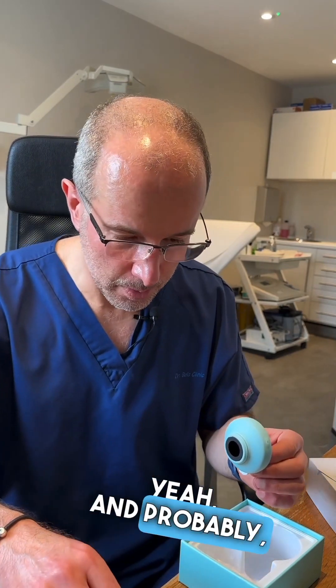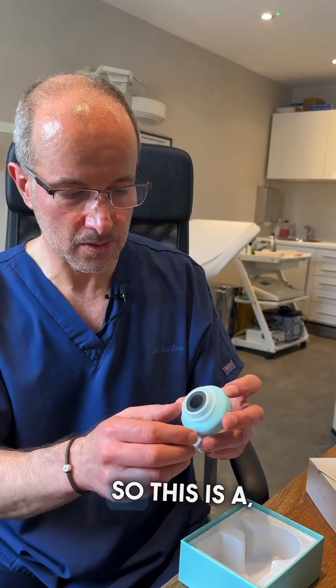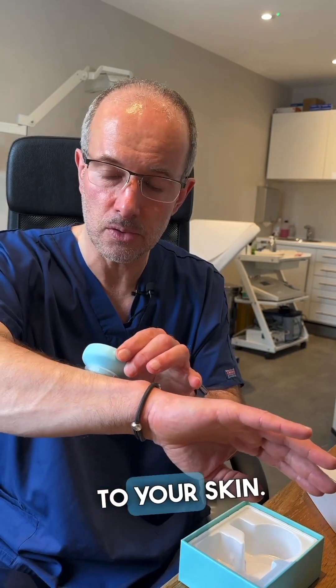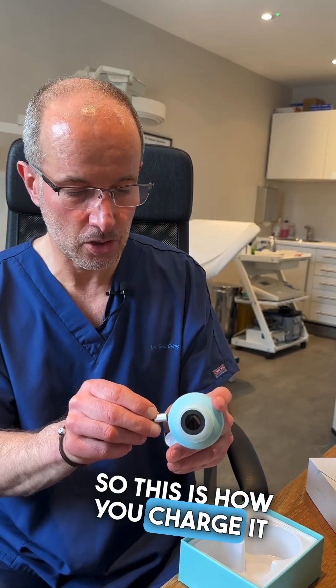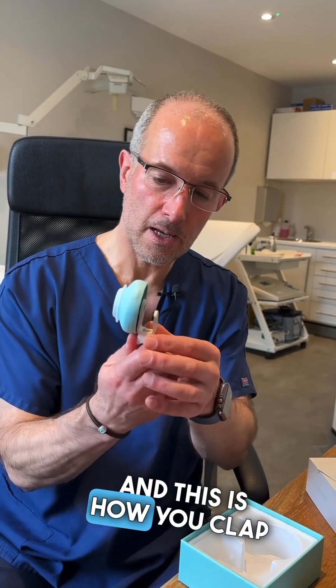This is a very important part of the dermatoscope — this is the front contact plate which comes straight to your skin. And just to see the difference: this is how you charge it here, and this is how you clamp it on the phone.